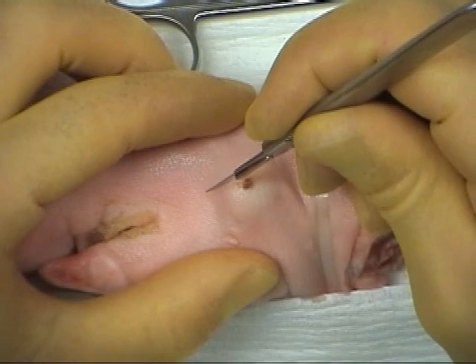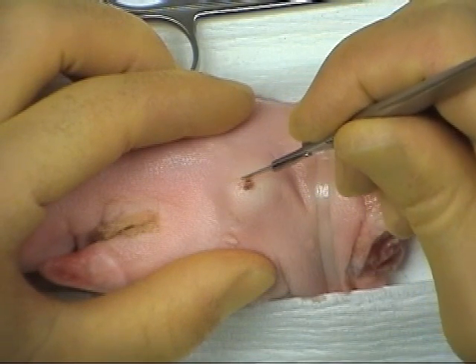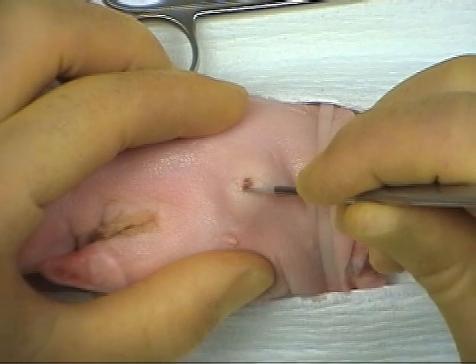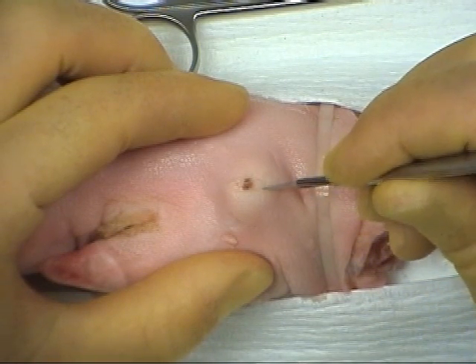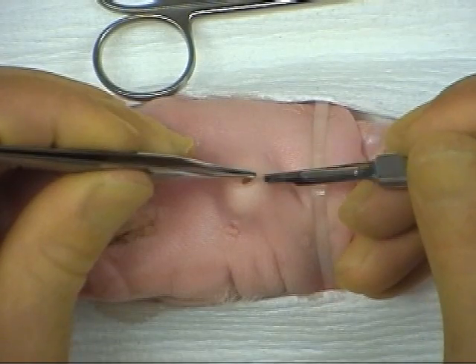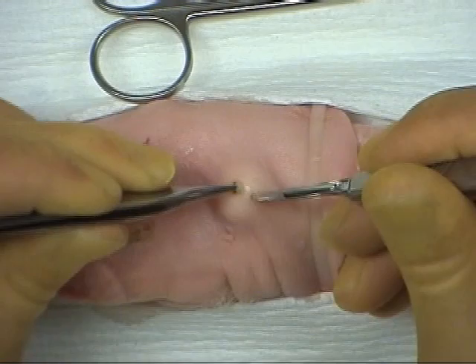Holding the skin under tension, the incision is made using the belly of the 15-scalpel blade in a pencil grip. It is not necessary to make a large incision around the whole cyst. A small elliptical incision should be made around the punctum, followed by lateral dissection around the cyst.